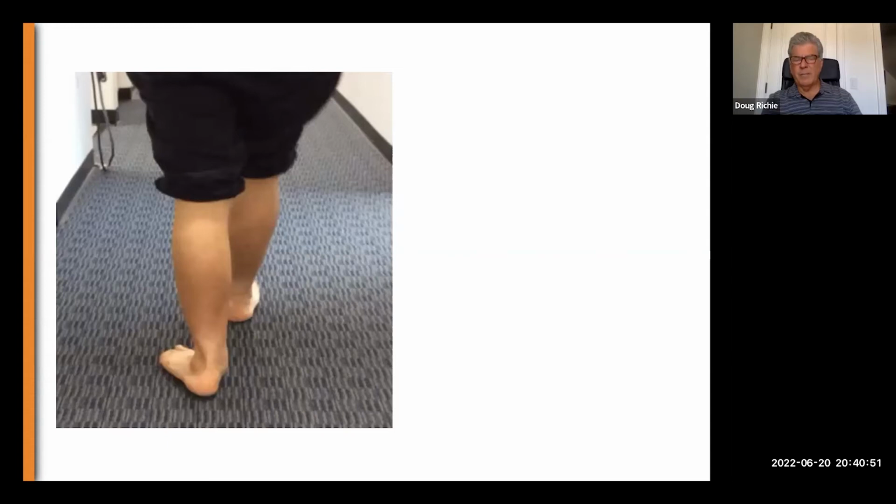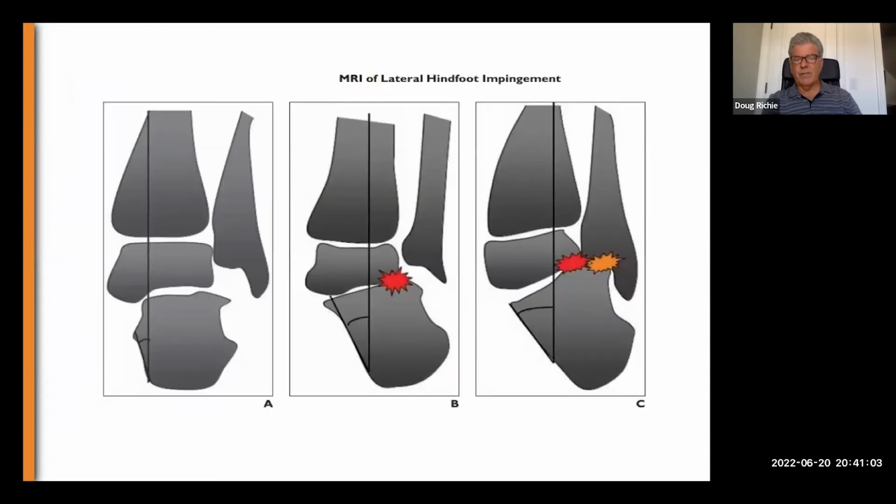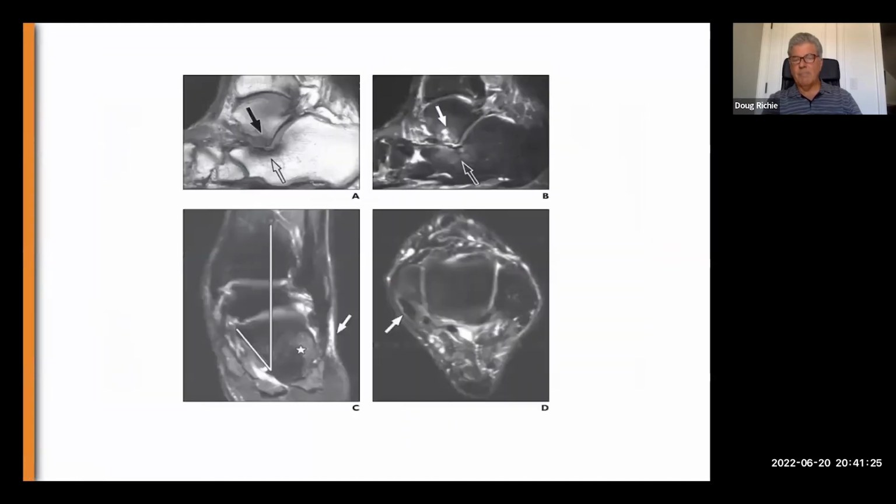We learned this concept when we were treating the adult acquired flat foot, because these patients get lateral compression of both the ankle and the sinus tarsi as the foot and ankle moves into extreme valgus. So as the foot, the calcaneus everts, the subtalar joint gets compression laterally, and we get sinus tarsi pain, and finally get fibula pain from the calcaneus abutting on the fibula. So our goal of bracing is to bring these bone segments away and decompress the areas of impingement.